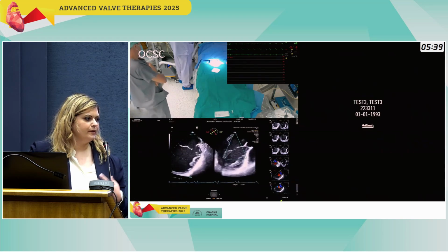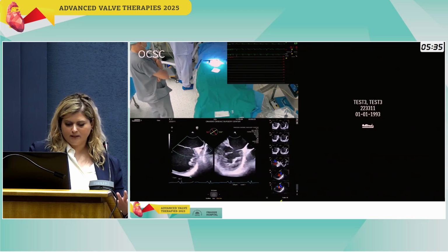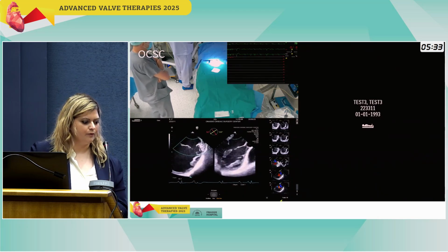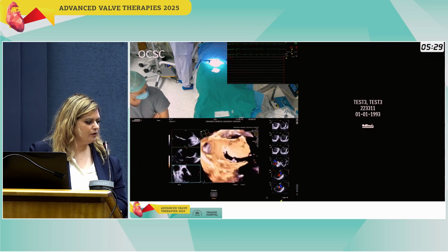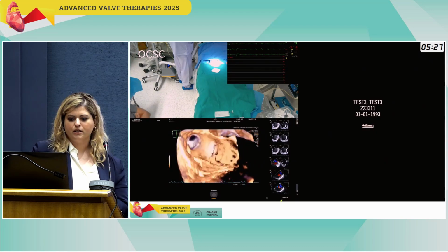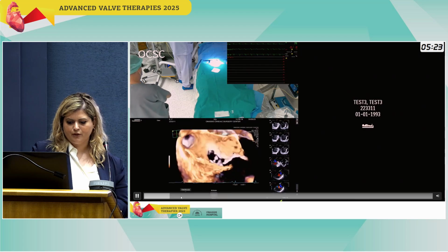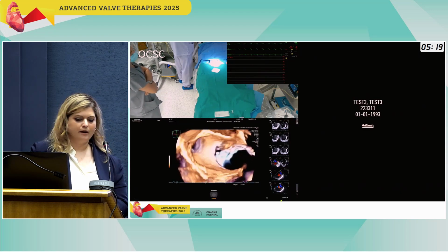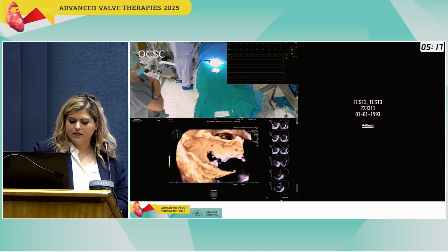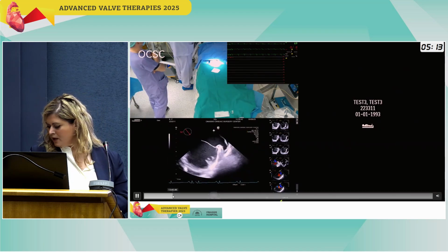And the whole team, the interventionalists and the echocardiographer, and the anesthesiologist, the whole team of the operation discusses the goal of this procedure and what we want to do. In this patient, we decided to go with a medial clip and see how much MR is left and do more work through.